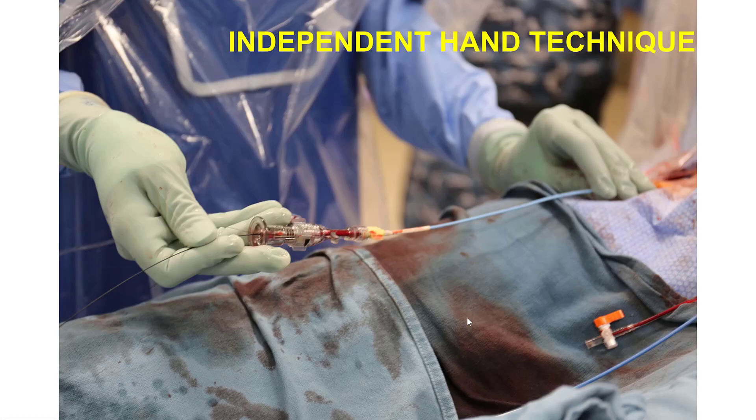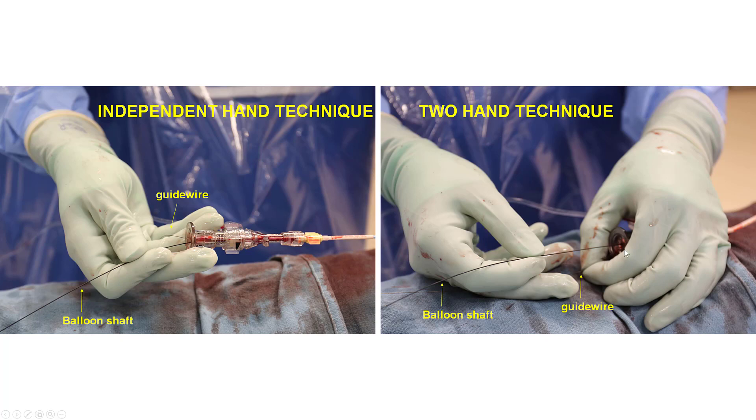The best way to deliver the stent is to use the so-called independent hand technique, in which the left hand is actually moving the guide back and forth — slightly withdrawing the guide — while the right hand moves the stent back and forth to ensure optimal positioning. This technique is preferable to the standard technique in which one hand holds the wire and the other advances the balloon, because here we have active guide manipulation. The independent hand technique provides the best chance for treating aorto-osteal lesions in the best possible way.